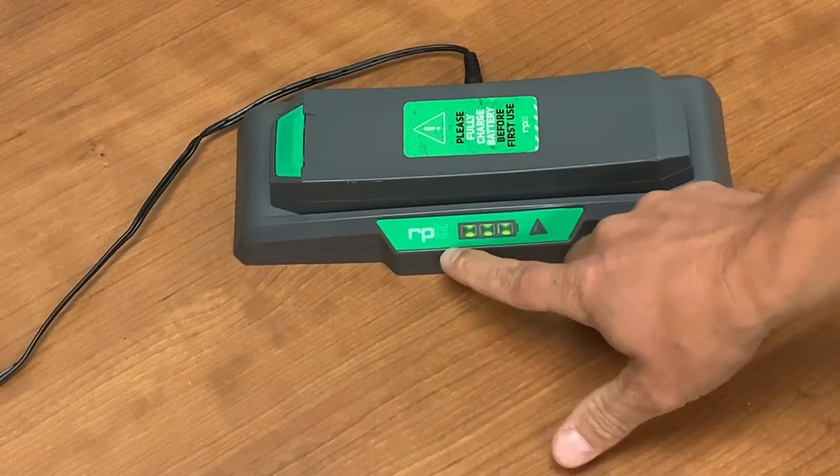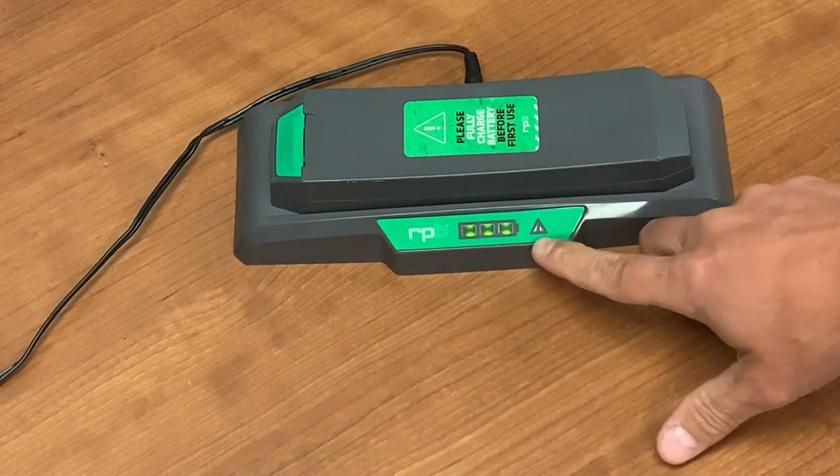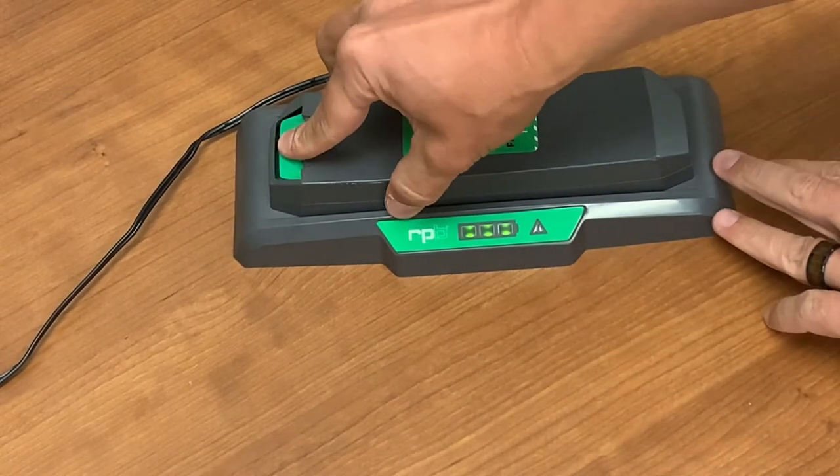There are three ways to check the battery's charge. While it is on the dock, there is a battery indicator. If all three lights are lit, the battery is fully charged. According to the RPB company, a fully charged battery can last up to 13 hours. To remove the battery, push down on the green button and lift up from that side.